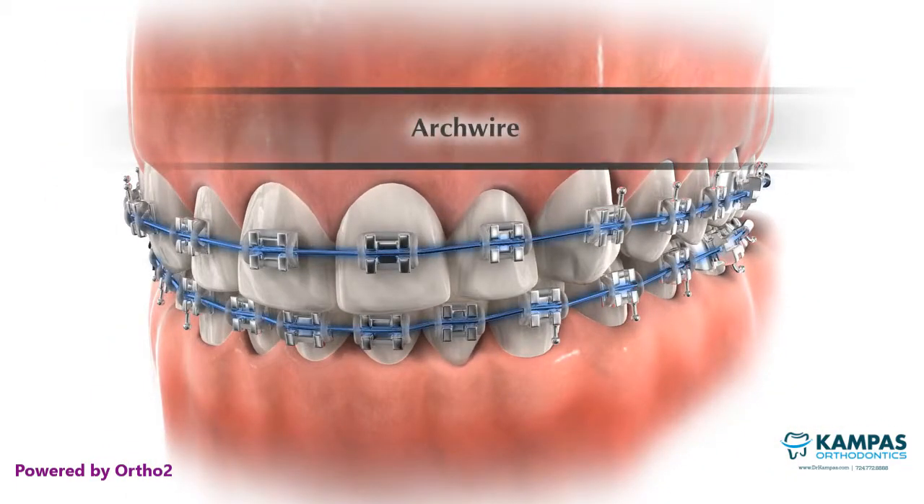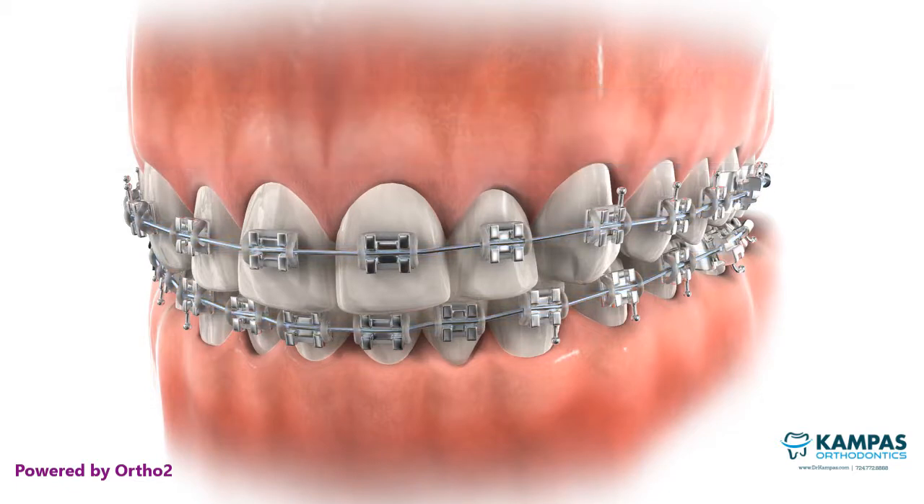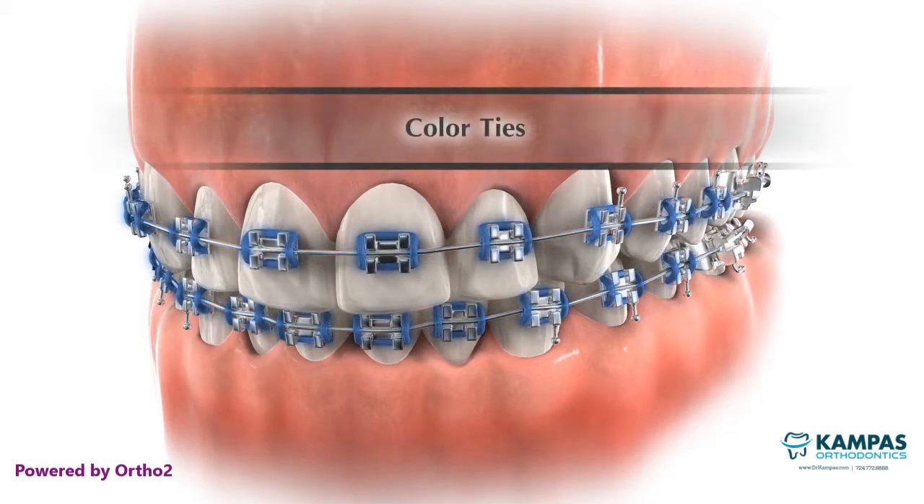The arch wire is a special metal wire that supplies a gentle force to the teeth. The color tie is a small rubberized donut-shaped ring that holds the arch wire into the slot on the bracket.